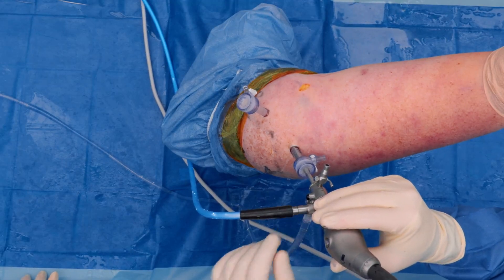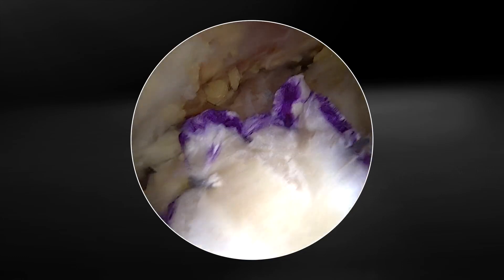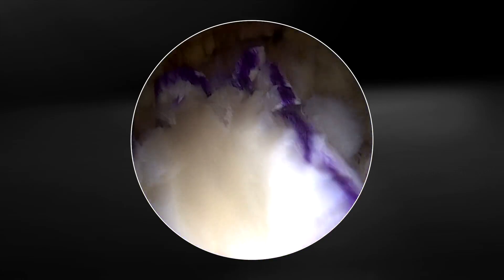My name is J.T. Tokish from the Mayo Clinic in Scottsdale, Arizona, and today we're going to be demonstrating an augmentation technique using the patient's own autograft biceps tendon using the Arthrex autograft compression device.